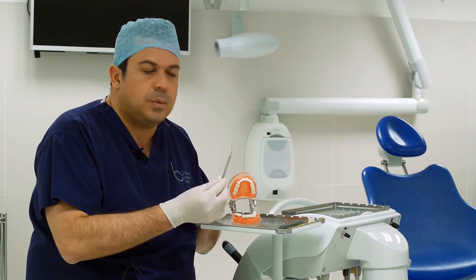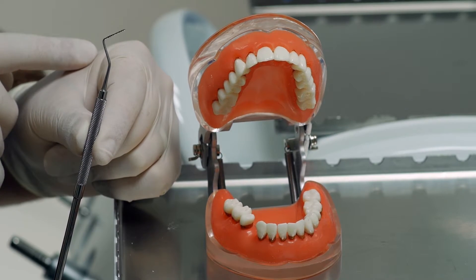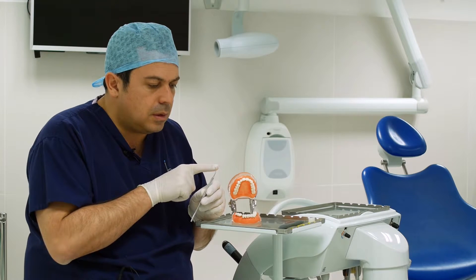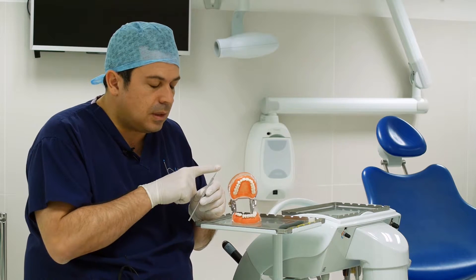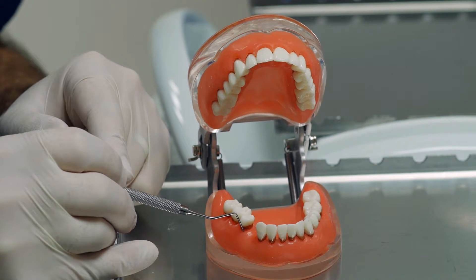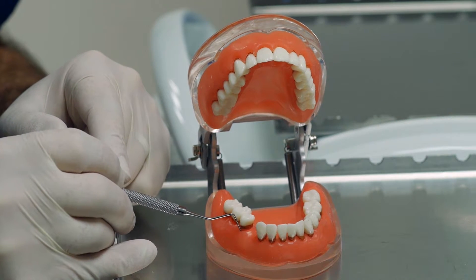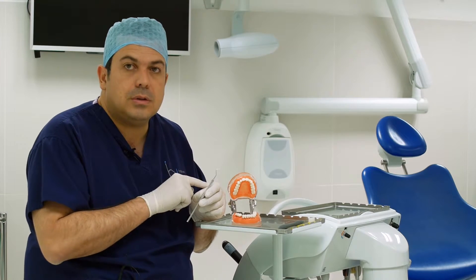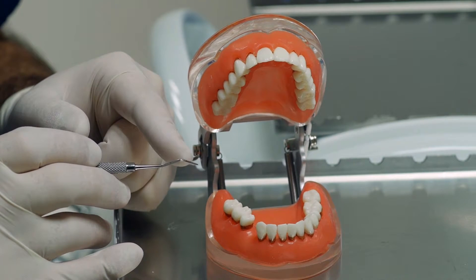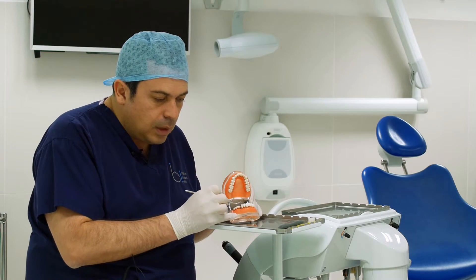This is what we use — it's a very simple little device called the periodontal probe. There are very different variants of this, but I'm just using this as an example. It's got small lines demarcating different measurements, usually in different increments, for the dentist to measure how deep this little probe goes in between each of the teeth.